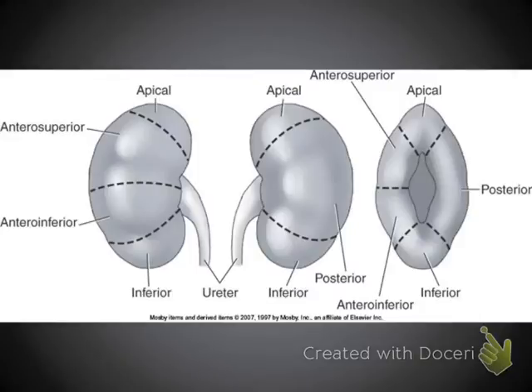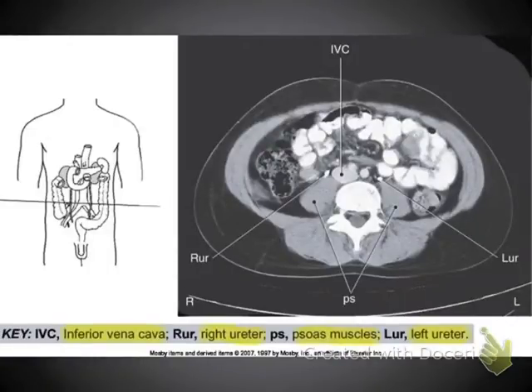Pretty much in this image, looking at this axial image, we see that we've passed the kidneys now, and we're working our way down towards the pelvis. And so we have probably the ileum, ileocecal valve going into the cecum here. We have jejunum here and working on ileum there. But really what we want to focus on is the relationship of the ureters to the psoas muscles.